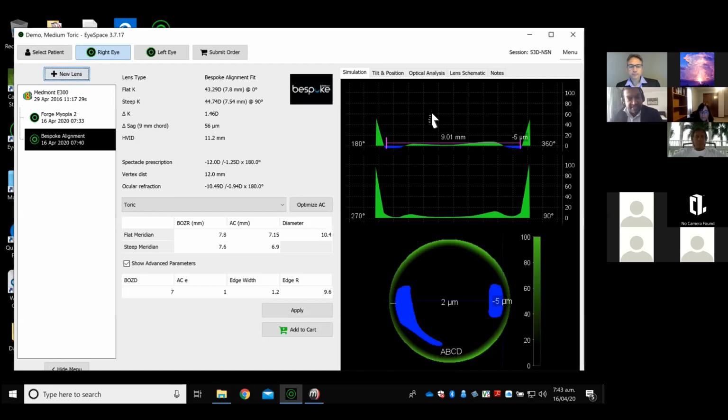Well, Charlotte, just actually a question. When you're designing bespoke and it's a daily rigid lens, and just like we all have rigid lens practices, we all do things maybe slightly a bit different.